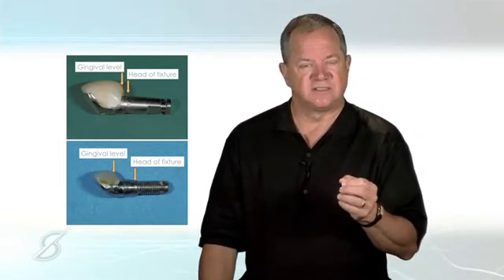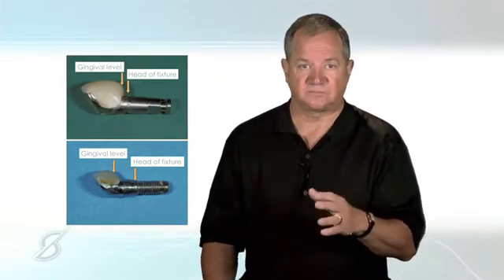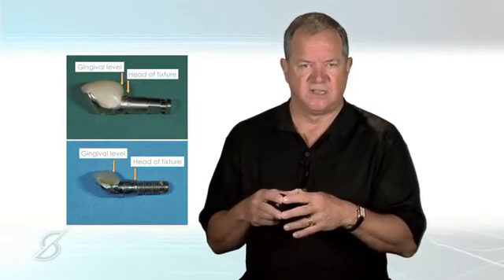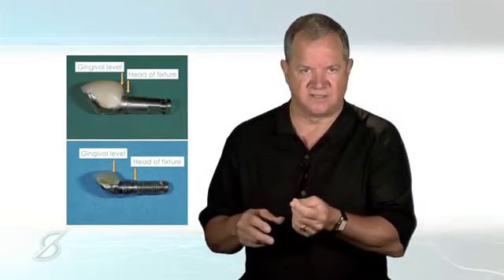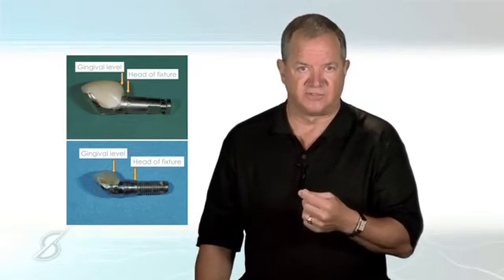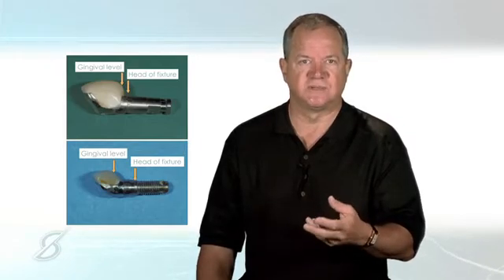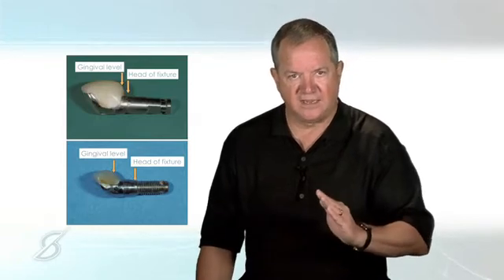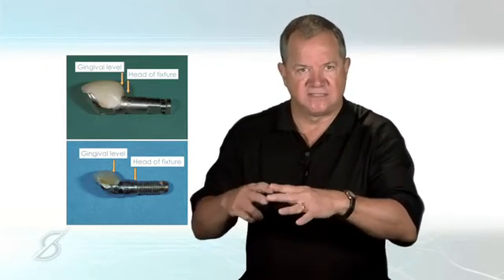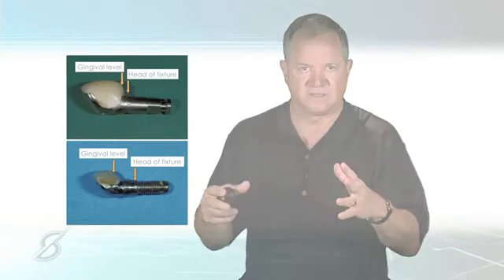Now, what you need to realize is when I go to put this in, the tissue is in the way. And I'm left with a couple of choices. I can try and cut the tissue out of the way to allow this to seat, or my preference typically is to always make sure when I'm doing any tissue molding that I use a screw retained restoration, and I just slowly tighten the screw down and it seats the restoration. The tissue will start to turn very white. It will start to blanch significantly because basically it's getting a lot of pressure put on it.